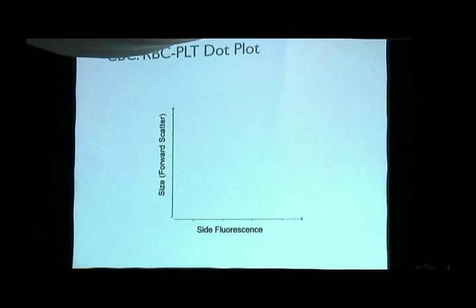what you're looking at in the vertical axis is size. There are about 34,000 to 40,000 dots in here, so they're all compressed in. That happens to be the largest red blood cell, and that happens to be the smallest red blood cell in this particular dog. If you were to measure from the top to the bottom and find the midpoint, that's the MCV, the mean cell volume.